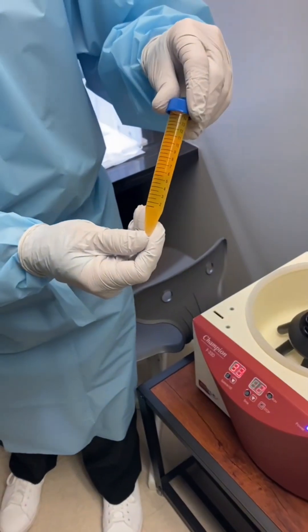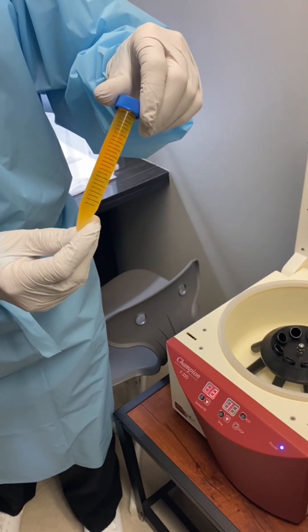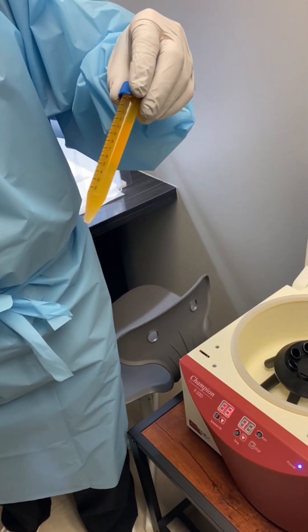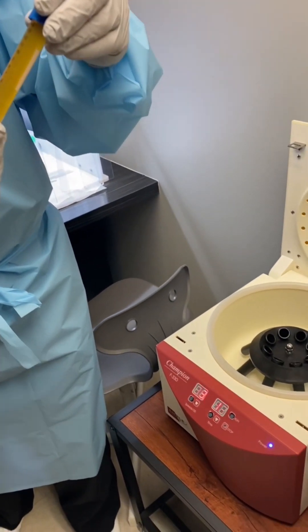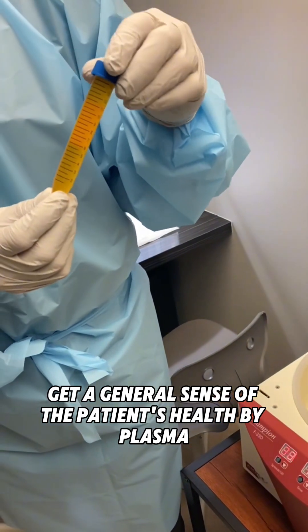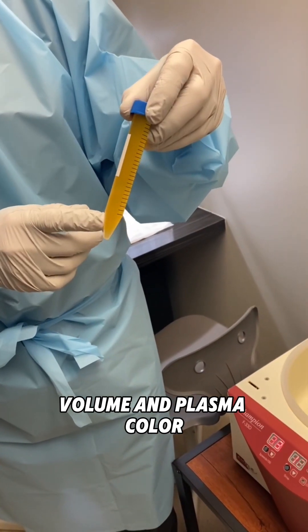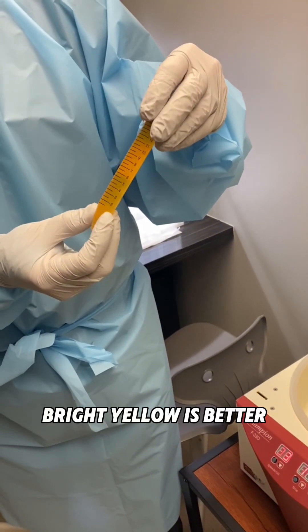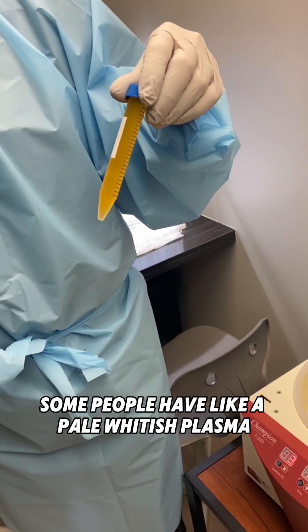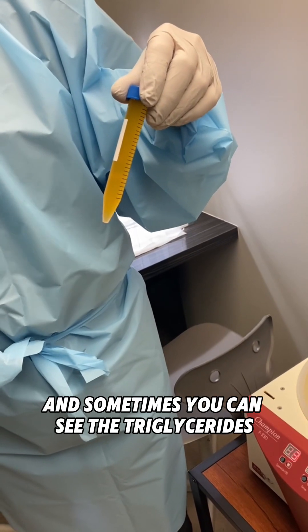Now we're going into our second spin. That's the four tubes down into one, essentially, with just the platelet-rich component. You can get a general sense of the patient's health by plasma volume and plasma color — bright yellow is better. Some people have a pale whitish plasma.